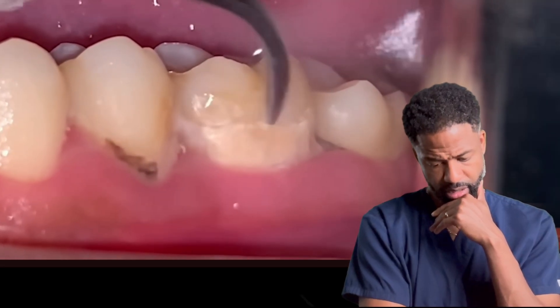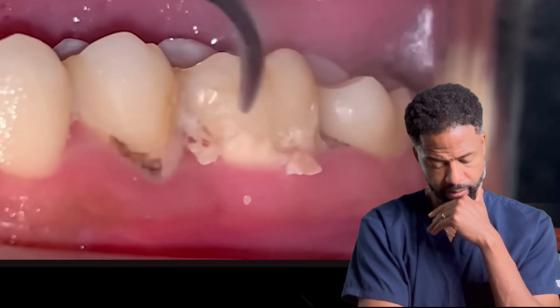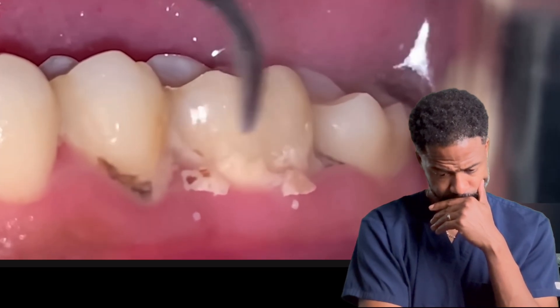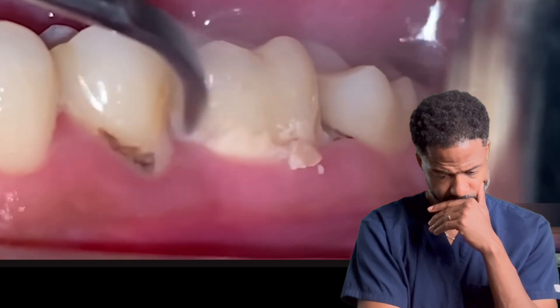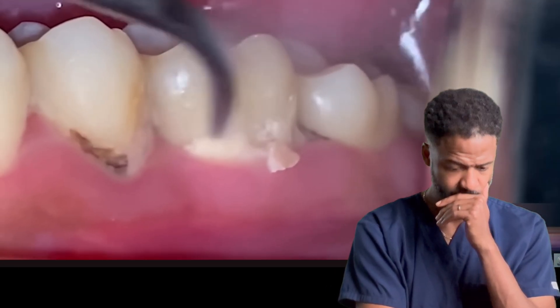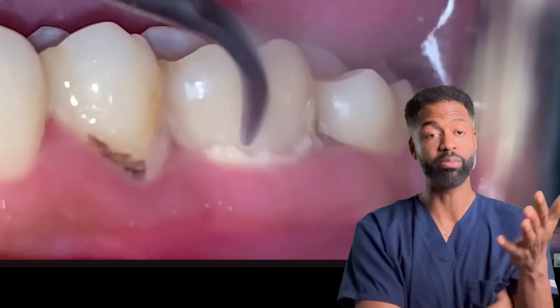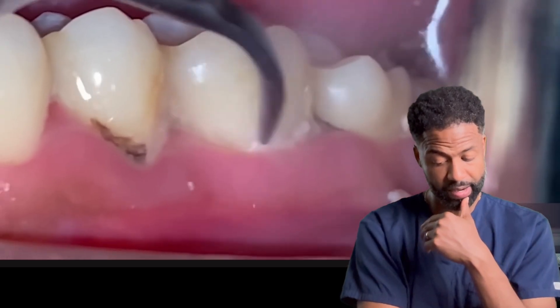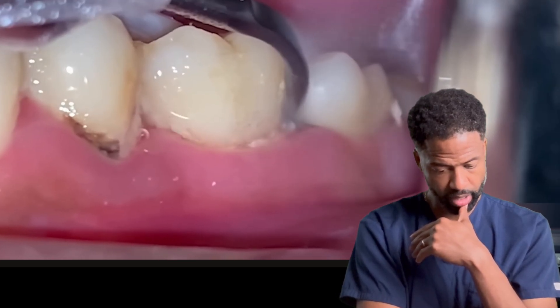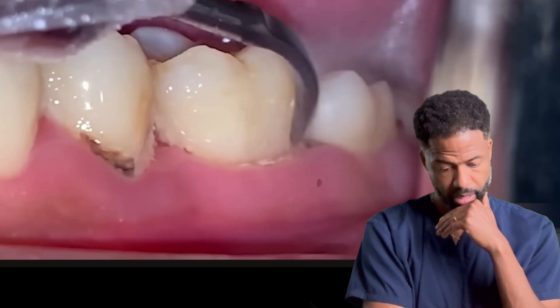They won't come up easily — might have to go a little bit under the gum line. See how that instrument goes right underneath the gum line there? They're breaking that off right there, going underneath the gum line. This patient is numb for sure.